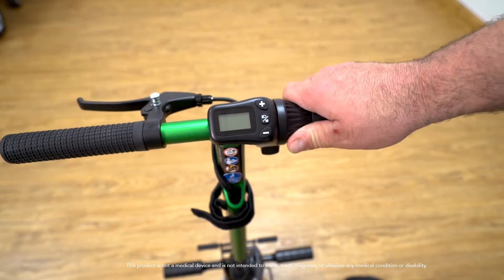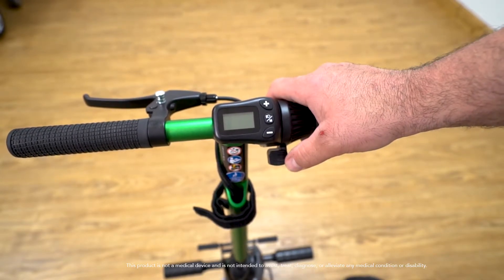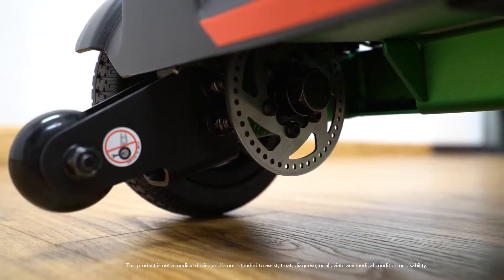The scooter utilizes both a thumb throttle or a twist throttle that you can activate with your hand. To slow the unit down, use the handbrake on the left of the tiller, which is connected to two rear disc brakes.